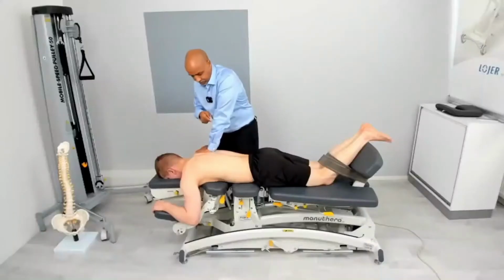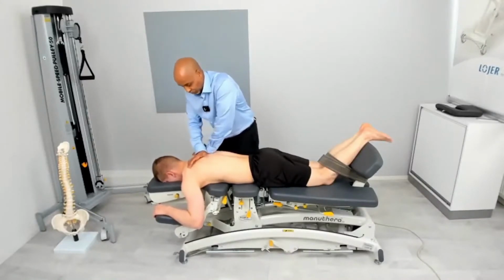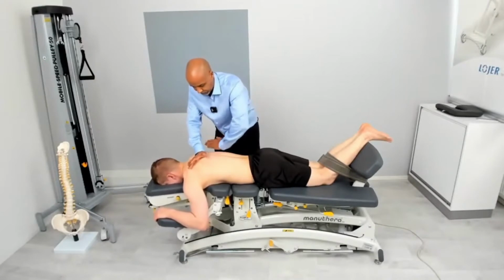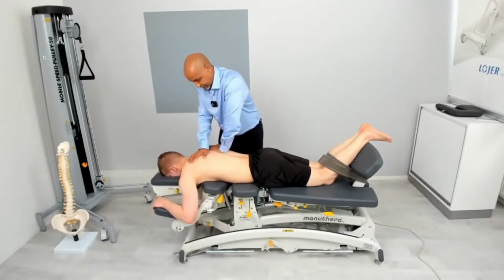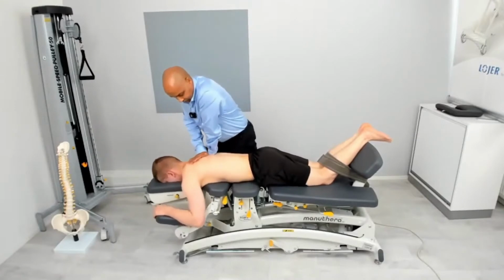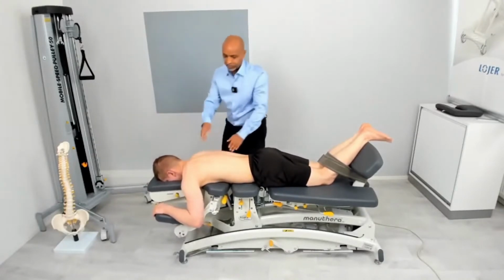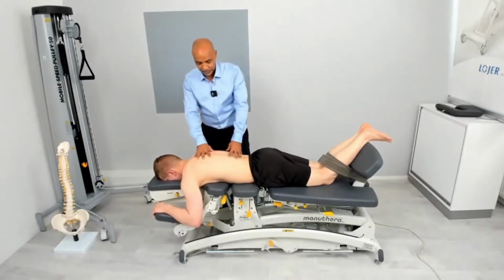And again, you're striking with this hand because the rotation is towards the left side. So you open up the area first and then you strike it. So this is the best technique. I found that it works better. So you're striking with only one side, and then you have to repeat it and do it on the other side.